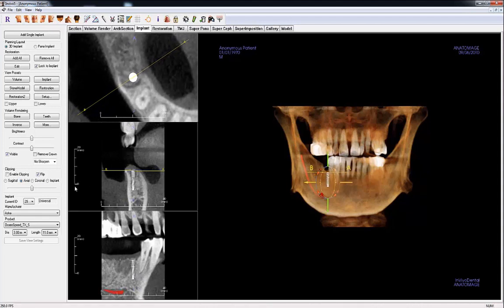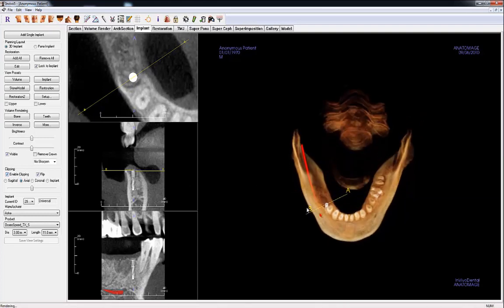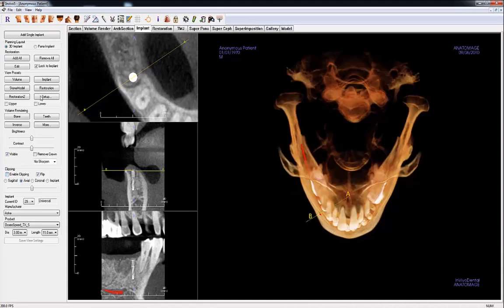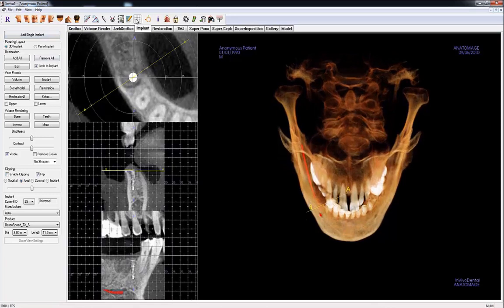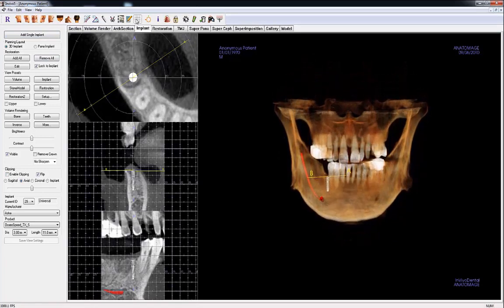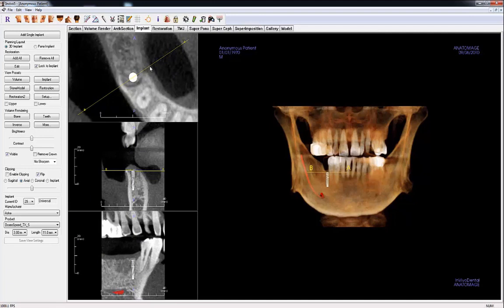You can rotate the implant with the orange rotational arrows and move the implant with the straight arrows. There are clipping options available that can help you view the implant position on the volume. In the cross-section view, you can turn on the grid to view distances between structures. You can move the implant by clicking and dragging the mouse. You may need to readjust the yellow AB line to be perpendicular to the arch.